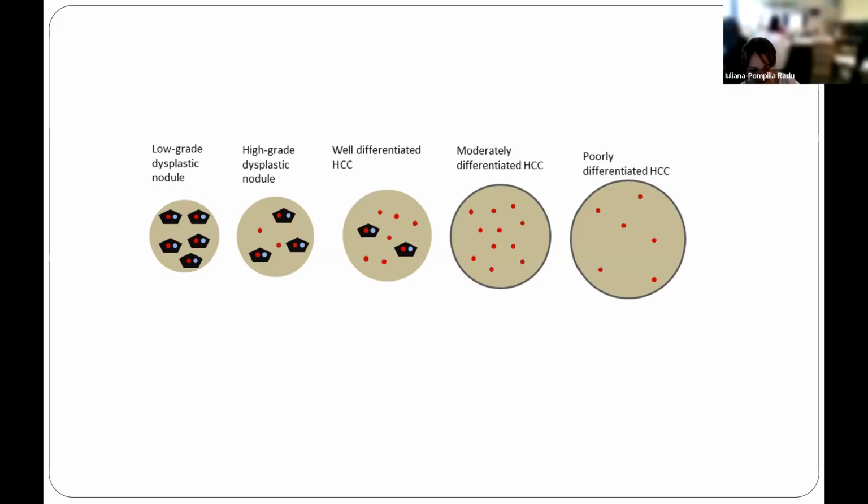So in Romania, because I speak from Romania, we guide the microwave ablation with ultrasound. The problem is that when we perform the microwave ablation, it produces a gas that is hyperechoic, and it's very difficult to see the lesion after you administer contrast. This is why we wait for 10 minutes, the gas disappears, and after that we inject the contrast. Then we see whether there is an arrest of activity or not, but we always wait about 10 minutes before we inject.